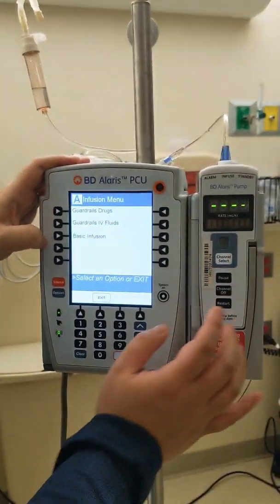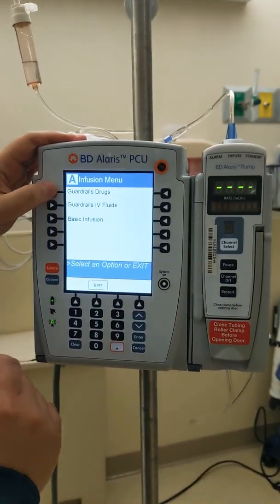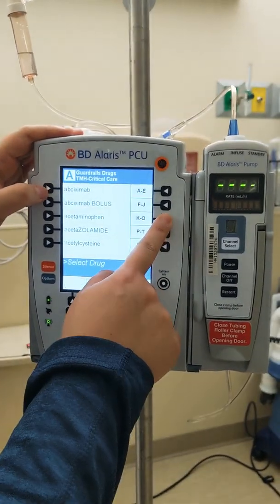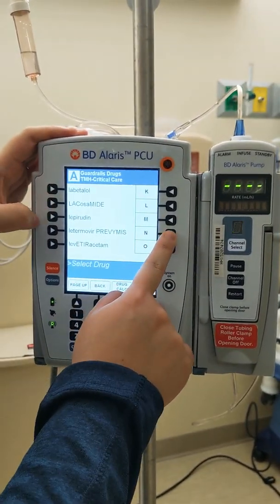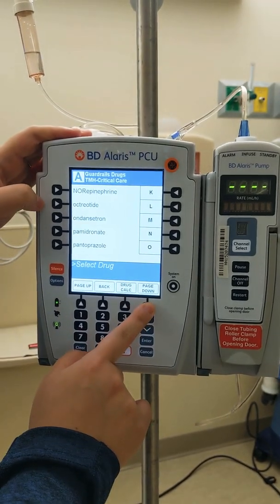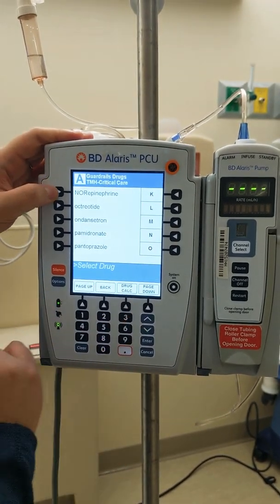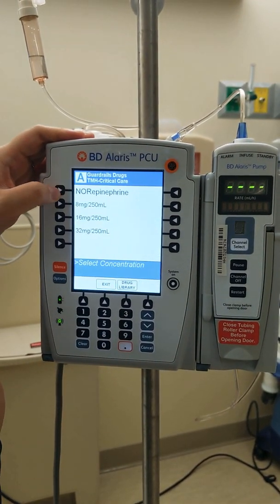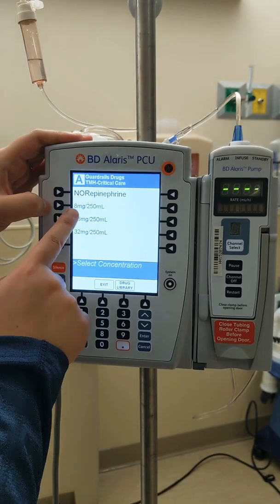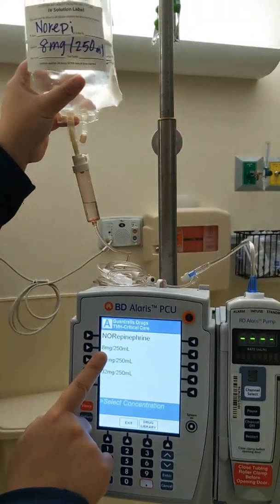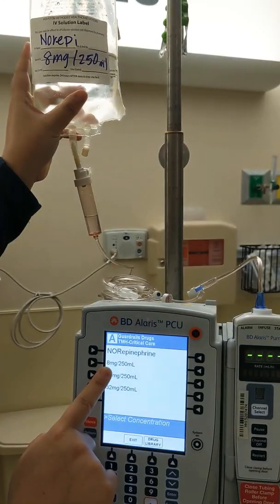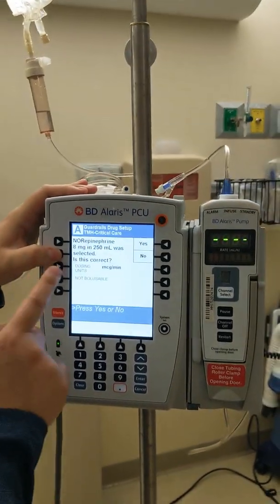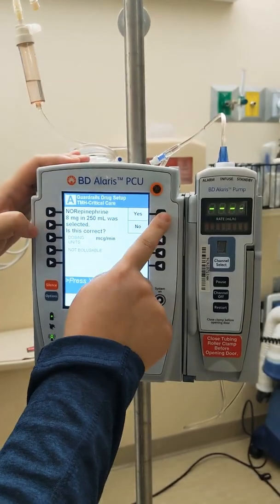Go to channel select, then go to the drugs. You're going to find norepi — go to N, and page down until you see norepi. It's right here. I'm going to choose 8 mg and 250. Make sure you have the correct one, and it says yes.